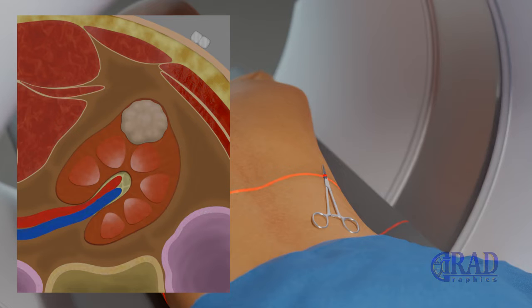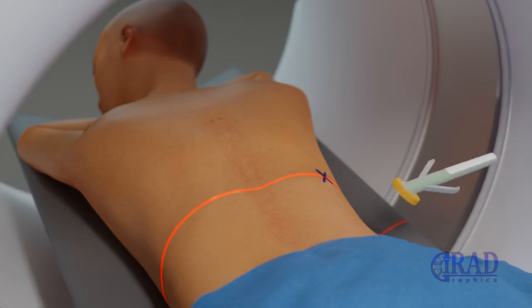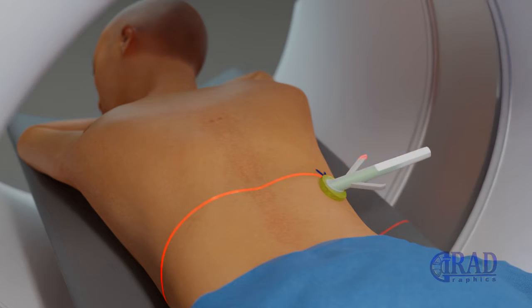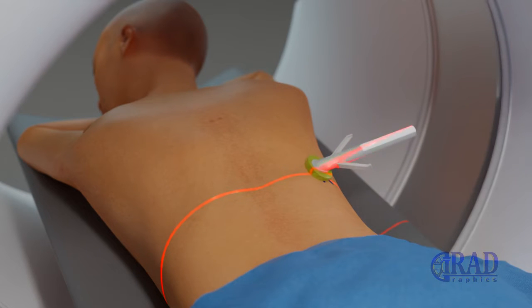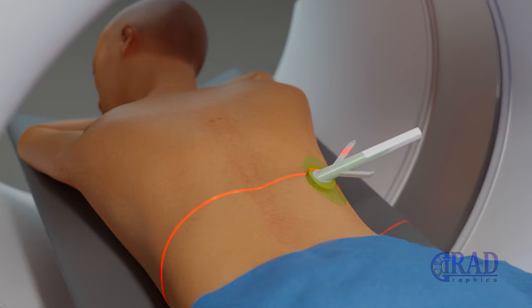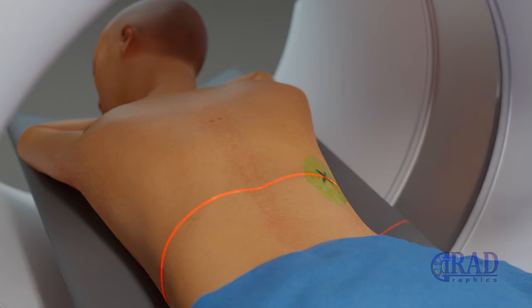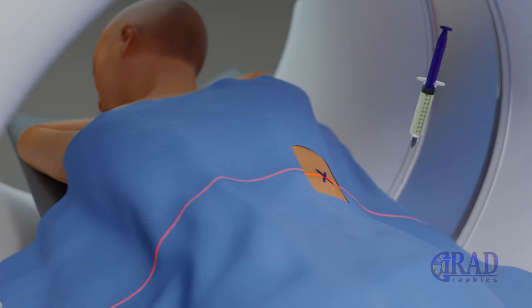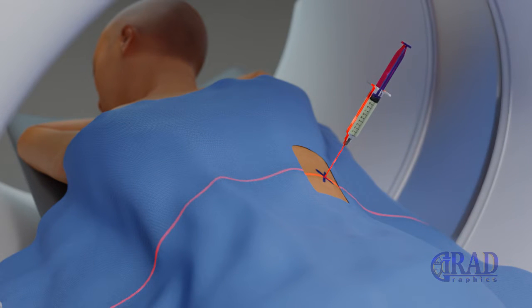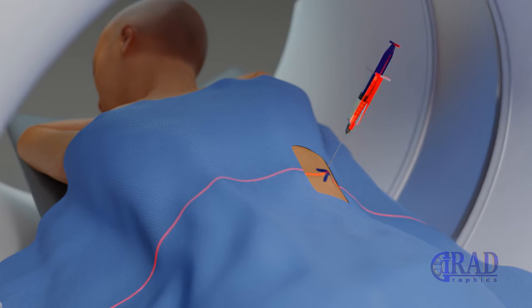The biopsy device cannula entry site is marked on the skin. Then the access site is sterilized, and the access area is covered by a surgical drape. The skin and renal capsule are numbed with a local anesthetic at the access site.